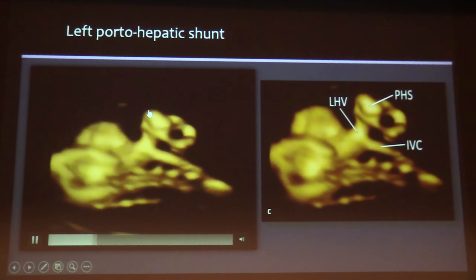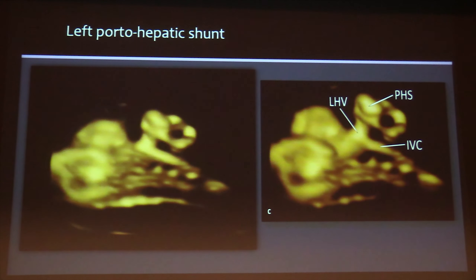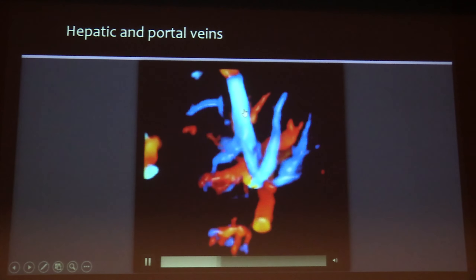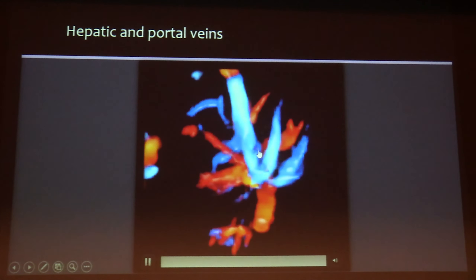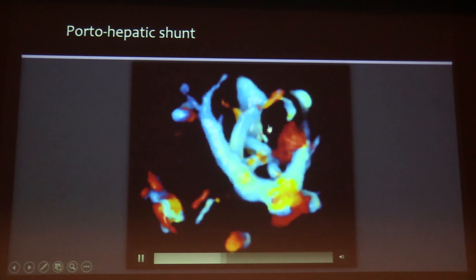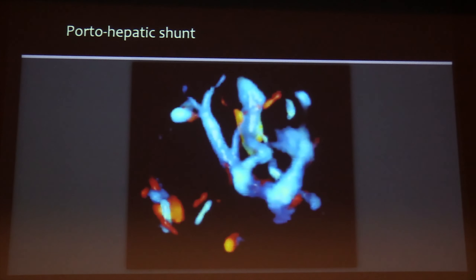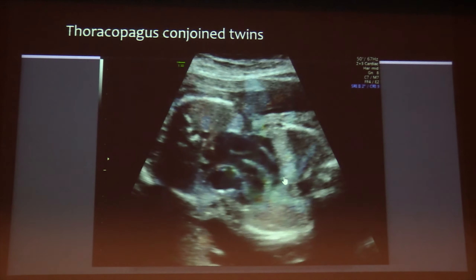For most hepatic shunts, both intra-hepatic and extra-hepatic, you can use HDPD or B-flow. The B-flow still has a place because it is very sensitive to low flow. You can see the portal vein, the hepatic vein trident, the umbilical vein, and the aorta — the whole system. This is a case of a porto-hepatic shunt: you can see the trident and an extra vessel — a shunt between the portal and hepatic system. 3D and 4D make it much clearer, and you can see not only one but two shunts from the portal system into the hepatic system.